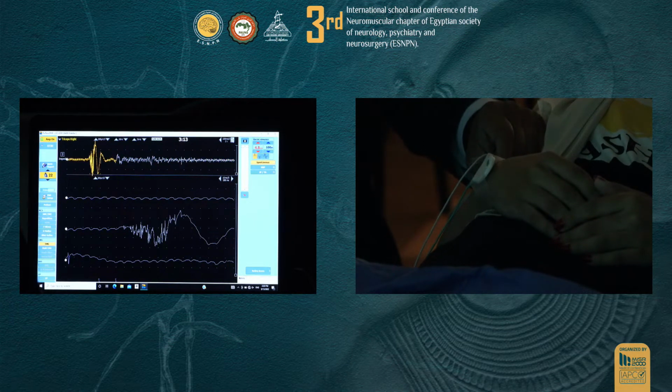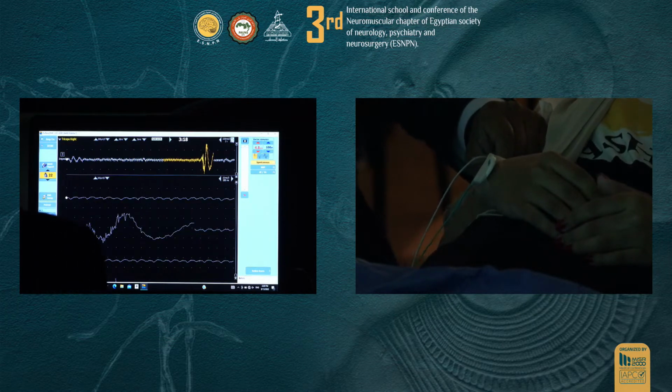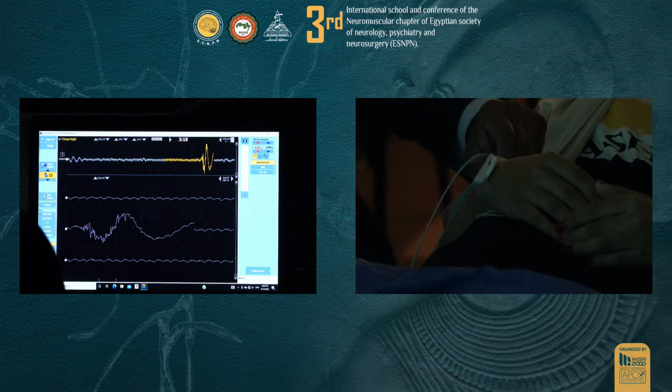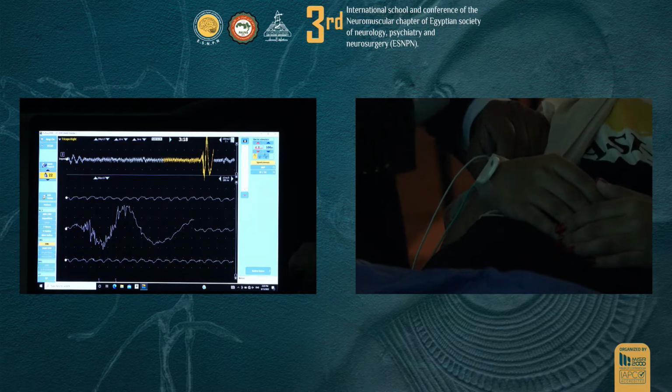I'll move the needle so you can see how long. I'll move the needle and see if I can stop it. So here it is, okay? This is insertional activity, and it should fire for a certain duration and then stop. Normally, we expect it to last less than 1/3 of a second.